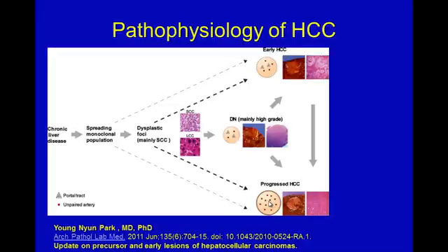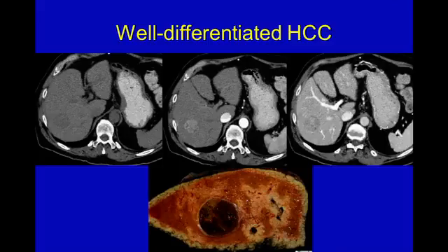Now you might say, what difference does that make on ultrasound to us? We really can't see that with our standard grayscale, but we will be able to look for that when we are using ultrasound contrast, as many people do all over the world.